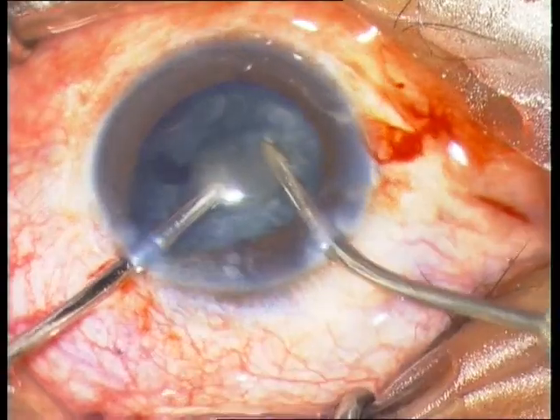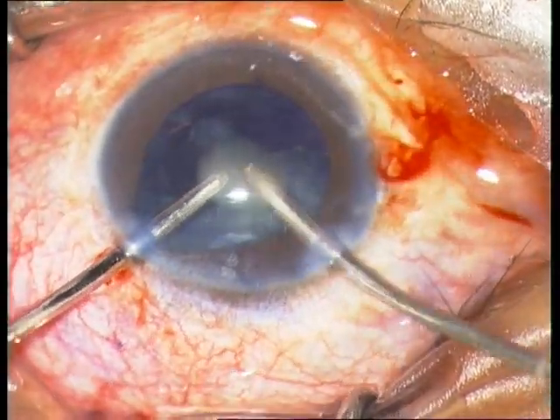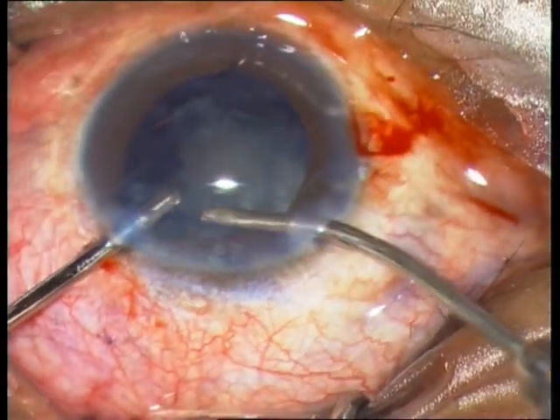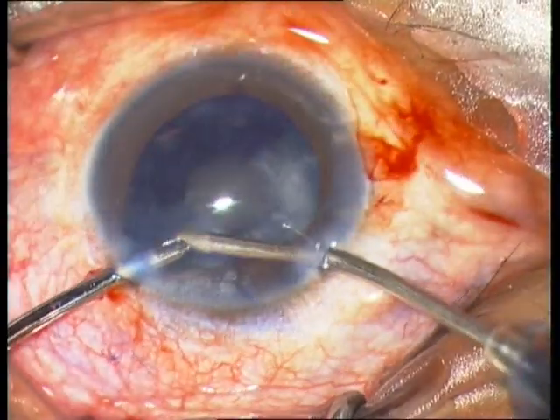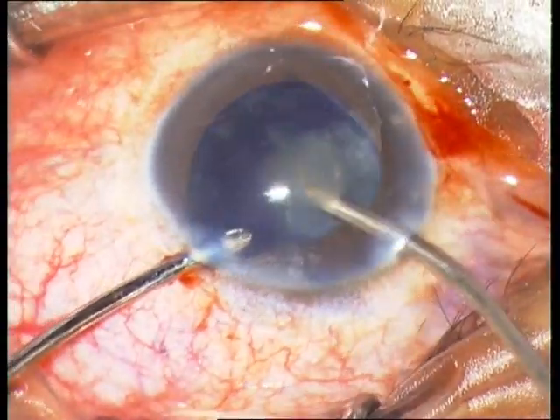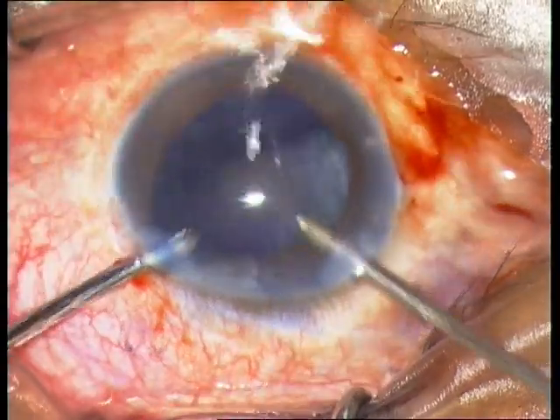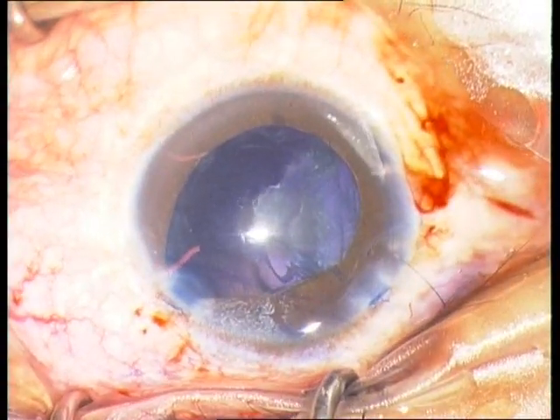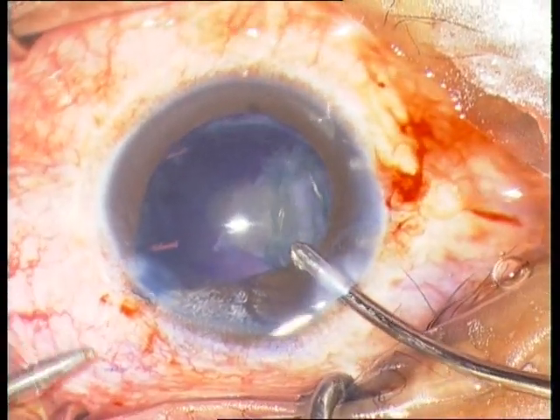If you look in the middle of the cornea, you will see a disturbing white area or spot. This is residual hematocornea. The cornea used to be completely white, like in the middle now, but it is much less after 8 months of waiting.